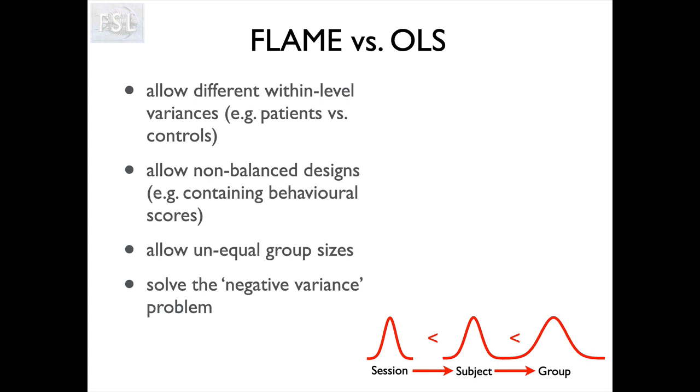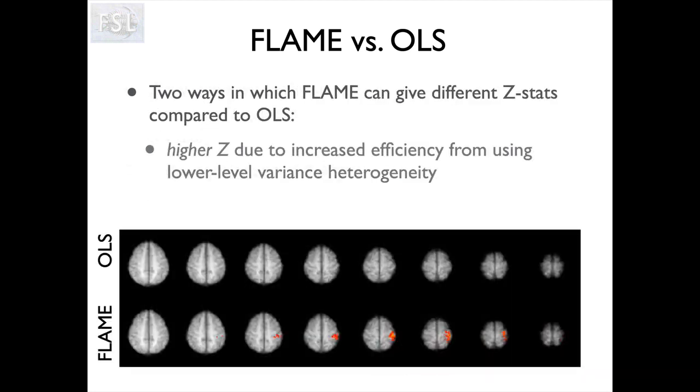And that's just not possible because variances always add. So the only way that would be true is if the between subject variance part was actually negative. And so that's why it's called the negative variance problem. You can't end up with a combined variance being less than either of the two constituents. And our first level variance we normally have quite a good handle on because we've got lots of data from our MRI. We've got lots of different images.